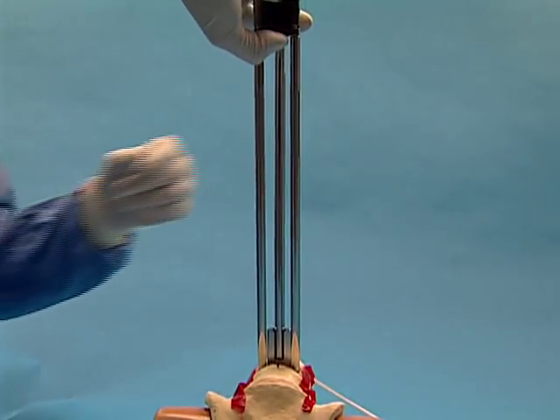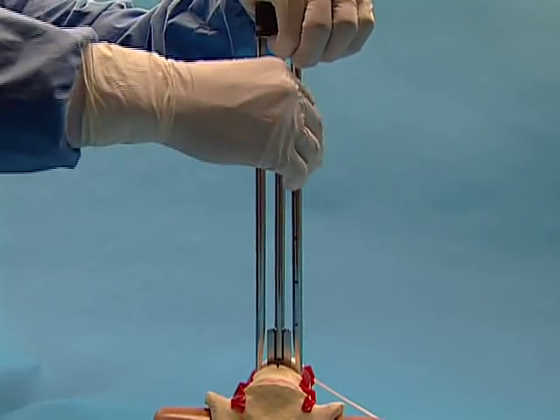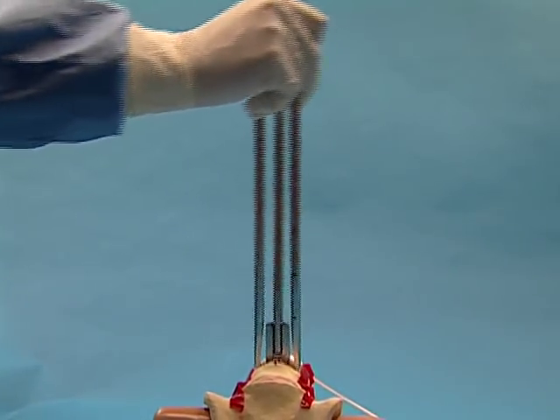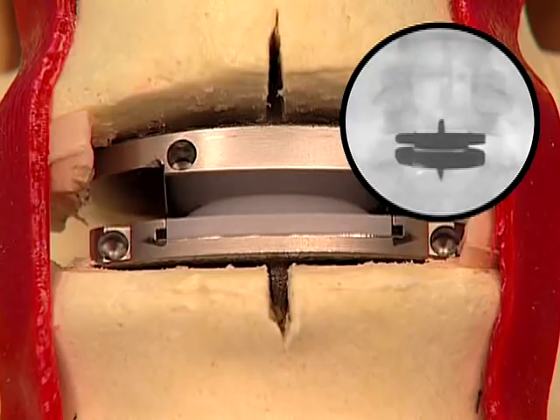Press the release button of the inserter and rotate the inferior arms outward to unlock the inserter. Gently remove the inserter from the ProDisc-L implant. Verify final implant position with lateral and AP imaging.